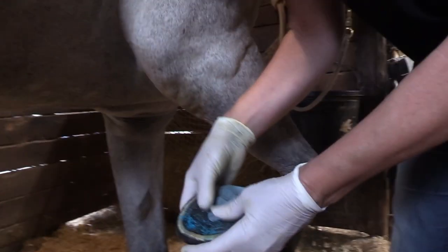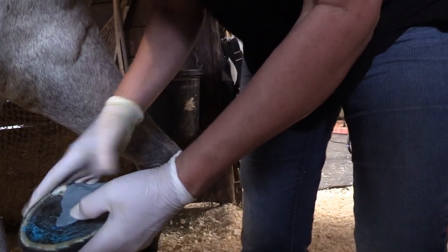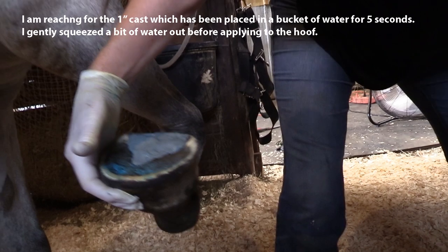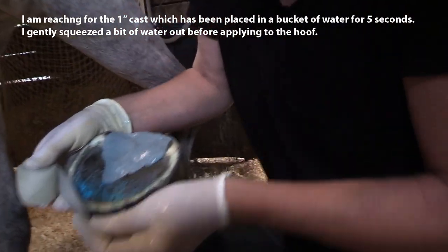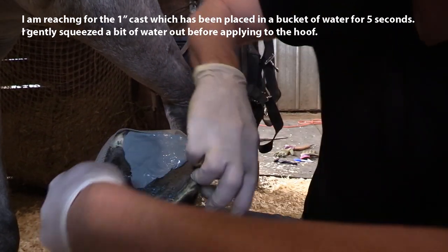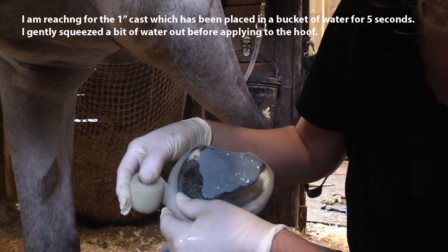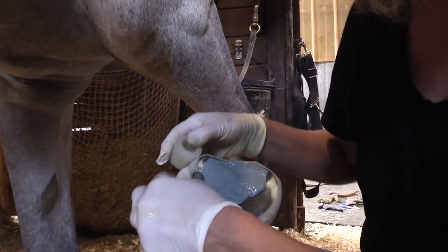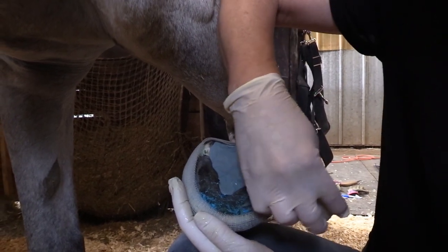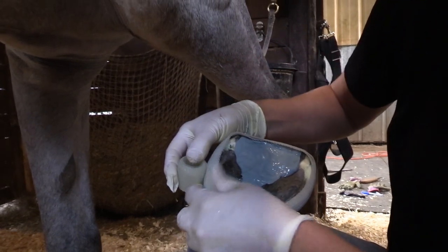Out the back of her heel, because I'm gonna put a whole nother layer in here. So that's all I'm doing, the dental impression. And then I'm gonna take this, and this is the part where you're gonna make your little lip. So that's all you're gonna do. See that? That's gonna make a little lip there. Makes sense. And it's gonna hold in the dental impression material when we do it again.